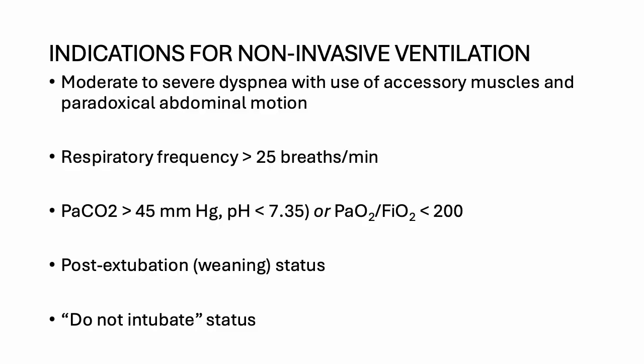So some general indications for non-invasive ventilation. Okay, when a patient has a do not intubate status but still may benefit from non-invasive ventilation. They may have severe dyspnea. Non-invasive ventilation may be initiated first, again depending on the physician and some of these parameters.